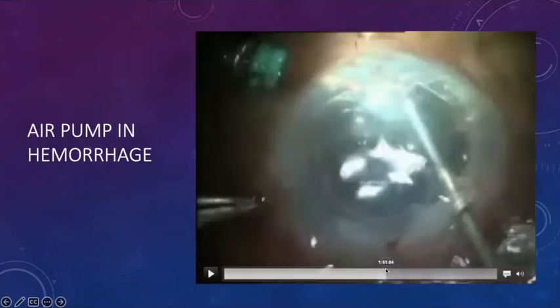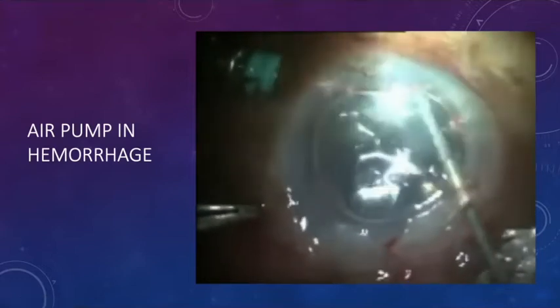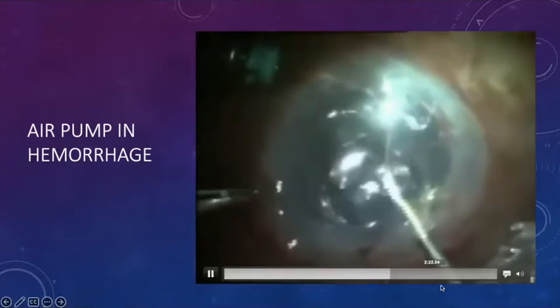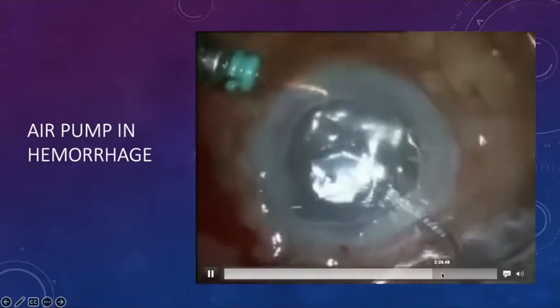So here again, you've got the air pump. You can remove those blood clots using a microforceps, and the air pump actually holds the entire anterior chamber formed and not collapsing when you go to intracameral maneuvers. So the AC can actually be reset in that it can be made to be a much better and quieter anterior chamber, which will of course give you a much better result.